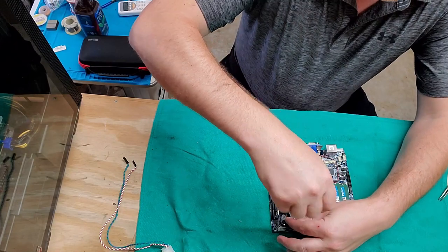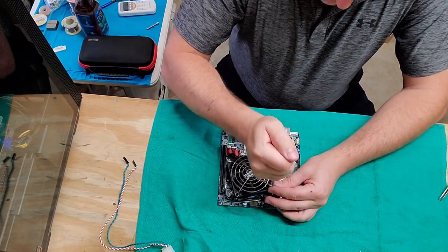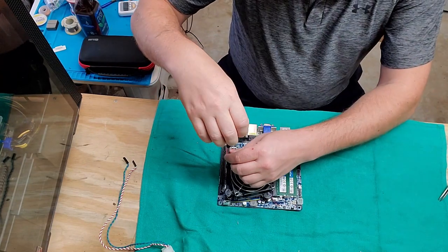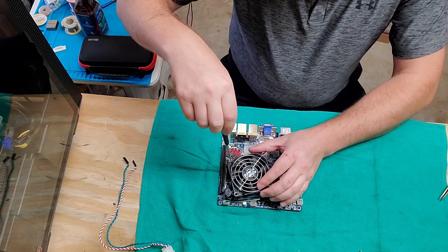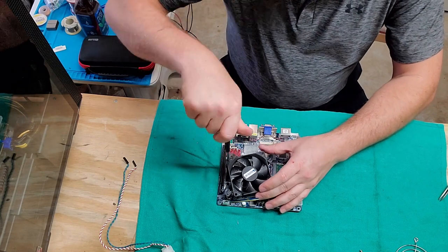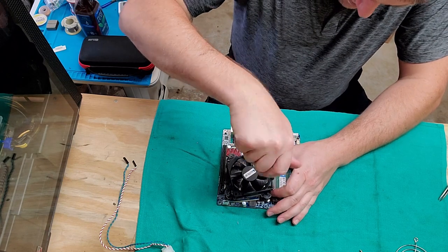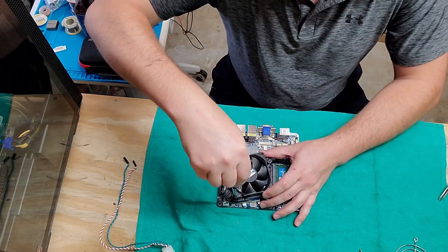We're going to find out what type of processor's on here, because maybe I could use this guy in a little arcade cabinet or something. I mean, look how tiny it is. What a neat little setup. Okay, we're going to pull this guy off so I can get to the fasteners that hold the fan on the heatsink. The whole thing's got to be cleaned anyway, so that's why I'm pulling it all apart.